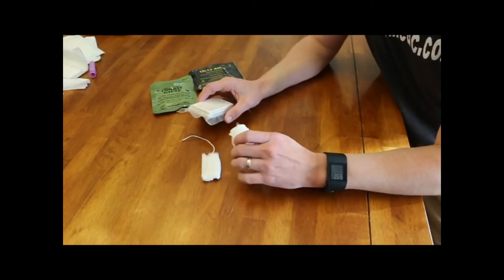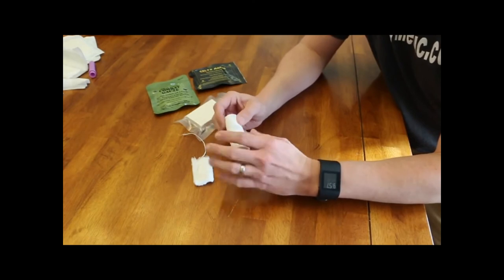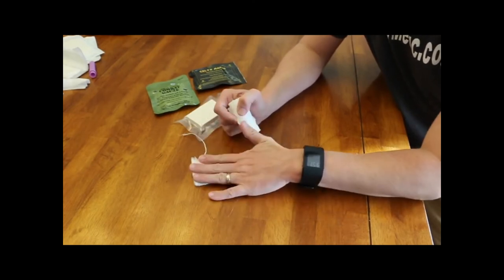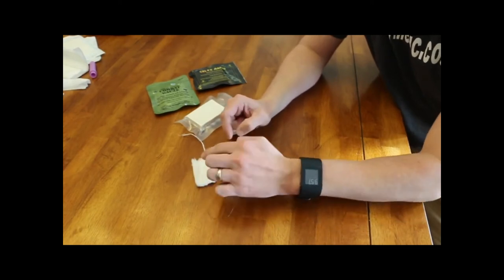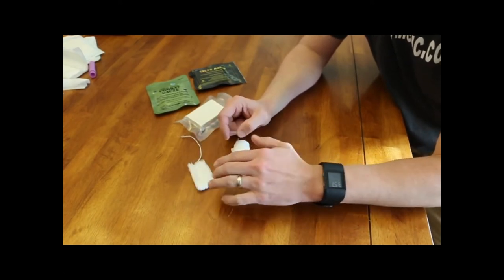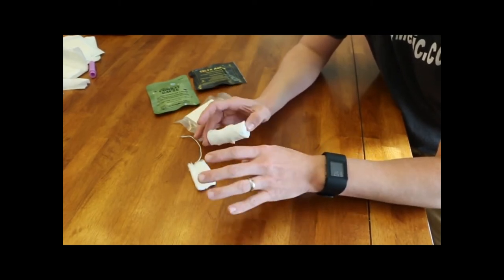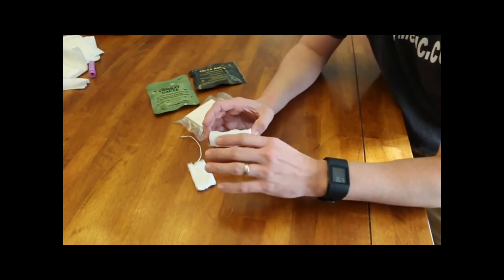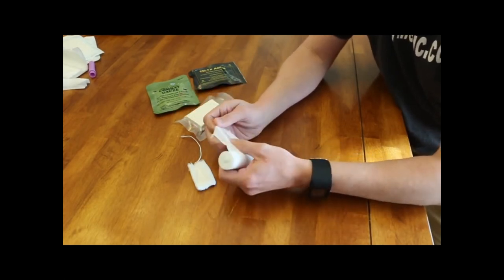All right, so let's lay this out on the table. Here's our tampon. Here's a roll of kling. Now, the one I opened up was sterile, but the tampon's not sterile, so that doesn't matter. You can buy non-sterile gauze, okay? Because this is not sterile, it has no need to be sterile. So a tampon is not sterile, doesn't matter. This kling that I opened up was sterile, which makes it a little bit more expensive, but you can buy the non-sterile for really cheap. So this is just cheesecloth here.